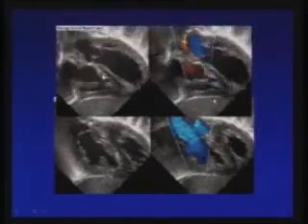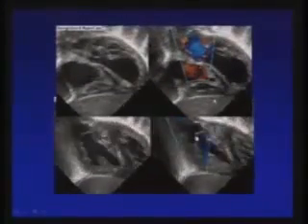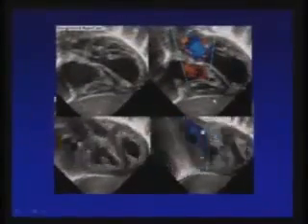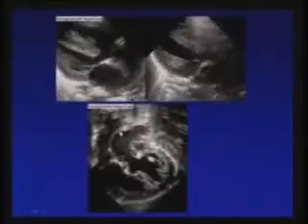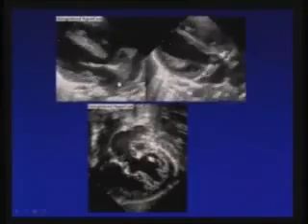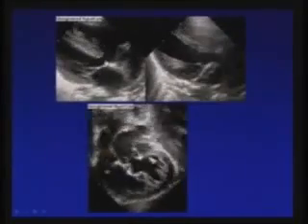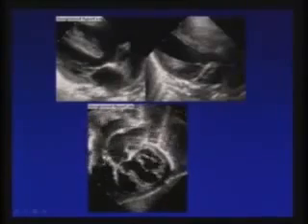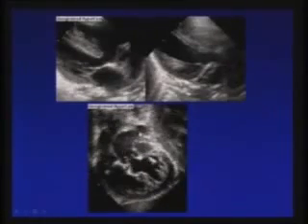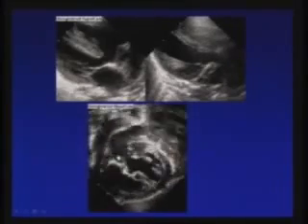This is again the same picture: pulmonary artery arising from the LV, bifurcating, PDA filling the pulmonary artery, and this is the aorta. A very small VSD is here, this red flow. This is the parasternal long axis view for the transposition of great vessels. What you see in the subcostal view, very important, is these parallel great vessels. This is the aorta, this is the pulmonary artery, which is bifurcating. So parallel running great vessels are a feature of malposed great vessels.